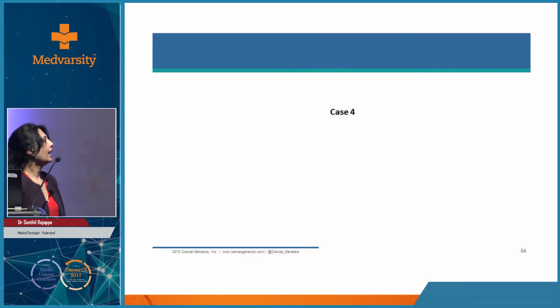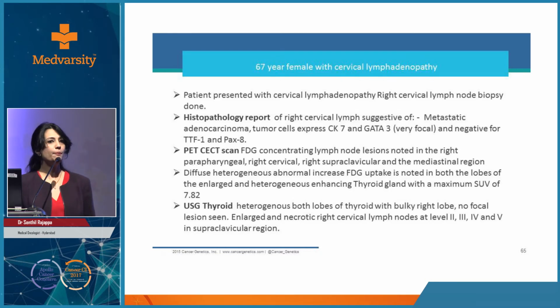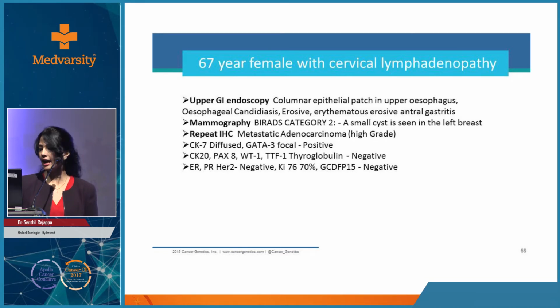So if you look at the lower scan, it is actually with mild PET pickup. The upper scan is post 3 cycles of chemotherapy based as a lung primary. Patient was treated with carboplatin paclitaxel and had minimal response in the lung area and actually progression in the bony lesions. Clear-cut progression in the bony lesions.